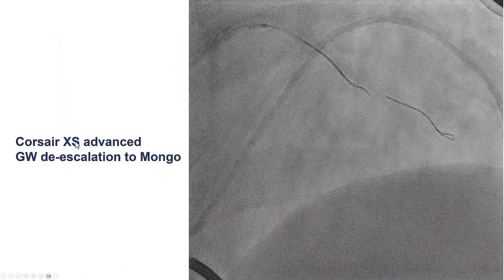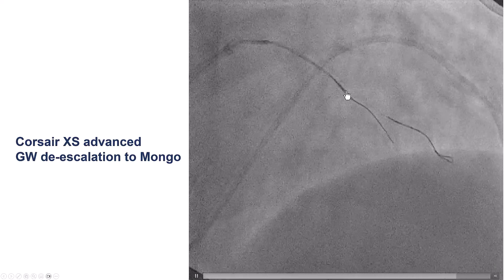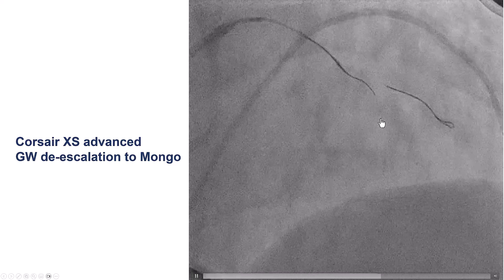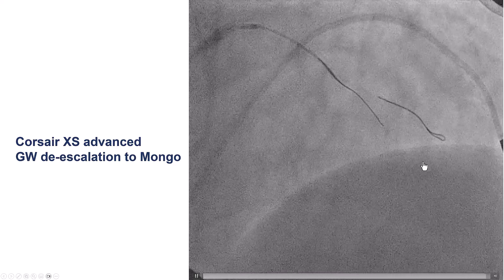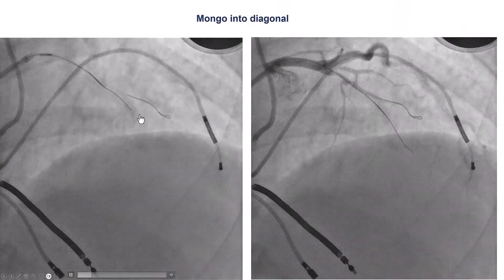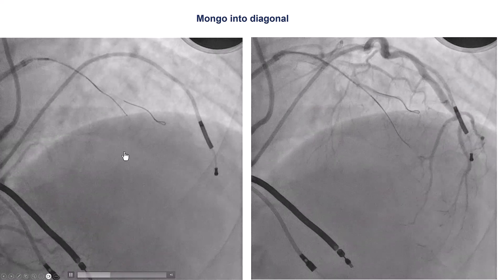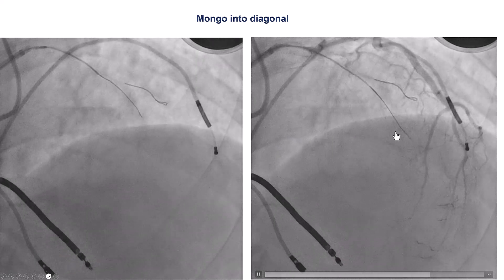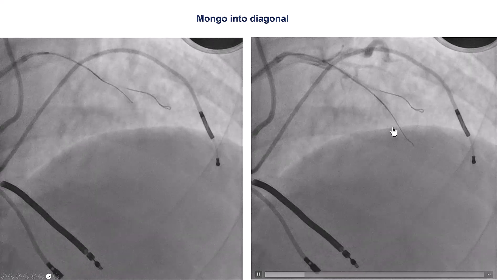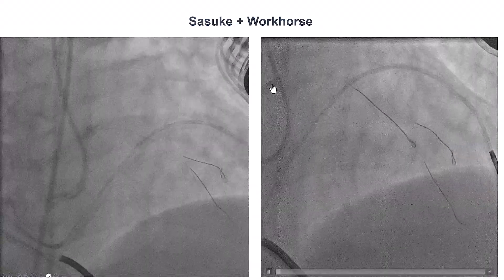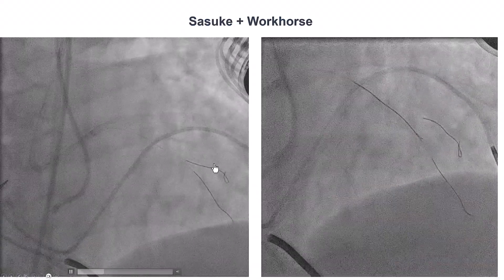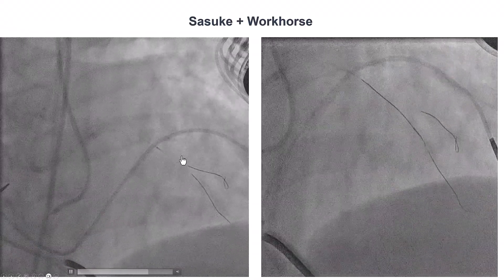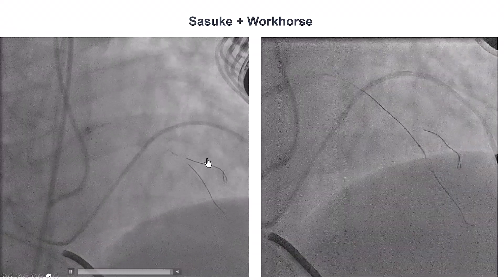We then advanced the microcatheter and de-escalated to a softer wire — a Gladius Mongo — that appeared to advance along the course of the vessel. On contralateral injection, we can see the wire going along the vessel course; however, the wire went into the diagonal originating at the distal cap. So what to do next? One option would be to pull back the side branch wire and redirect it, but that may lead to loss of wire position.